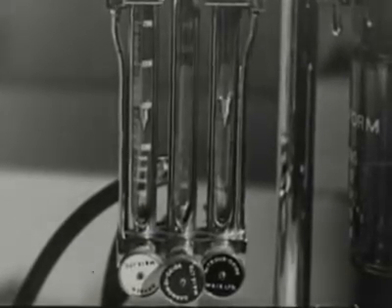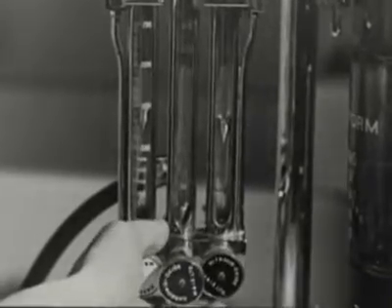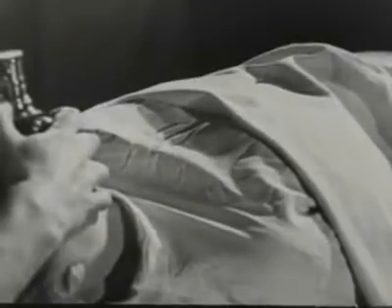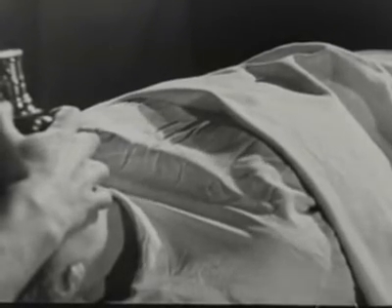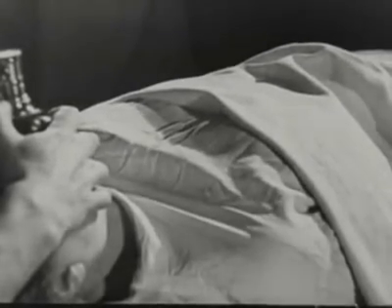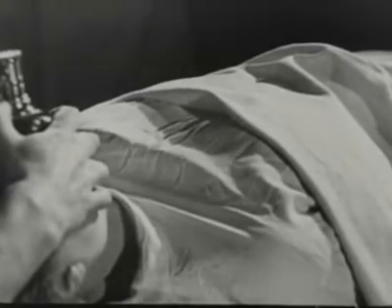This setting, with 5 liters of nitrous oxide to 1 of oxygen a minute, passing full over the surface of the ether, will produce light to moderate anesthesia according to the resistance of the individual patient, and the proportion of oxygen will be sufficient even over a long period.